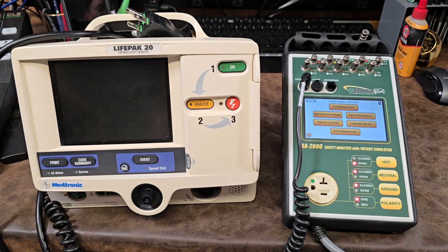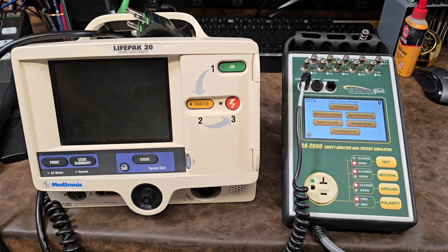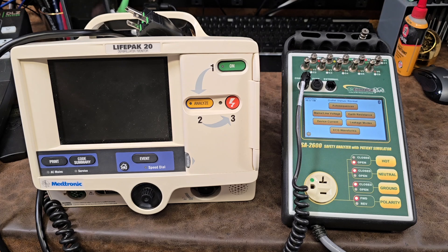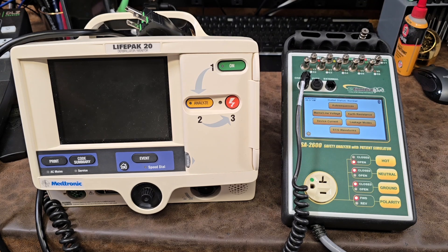Hey everyone, welcome back to Better Biomed. I'm going to show you guys how to do an electrical safety per NFPA 99, and to help me I'm going to use the BC Group SA2600. We're going to go ahead and do an auto sequence.